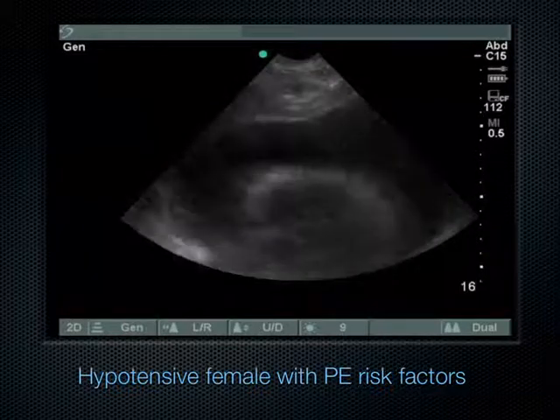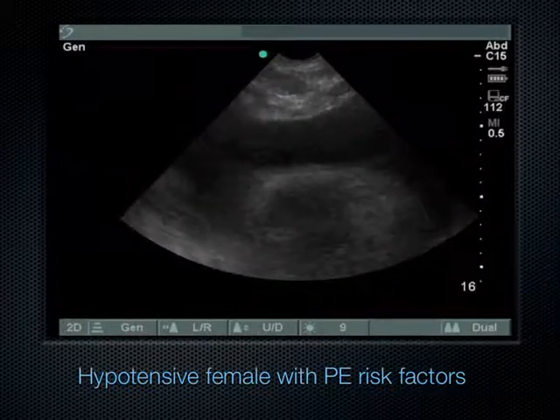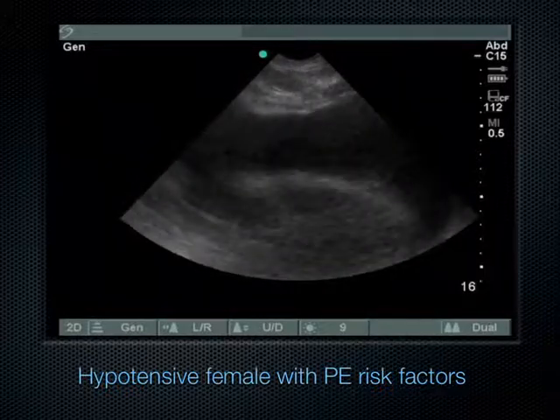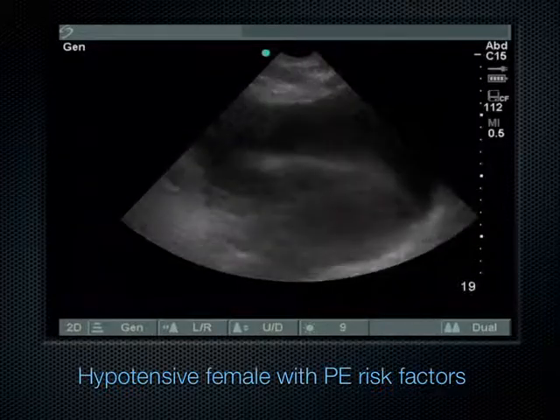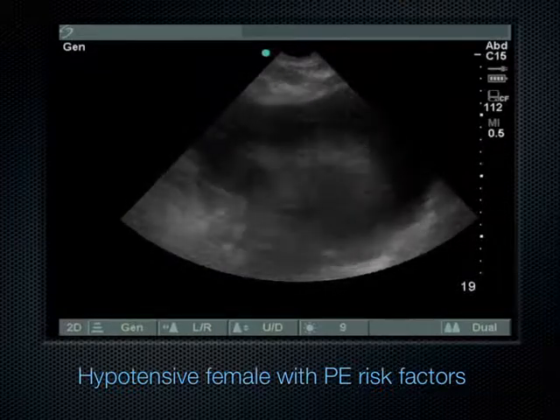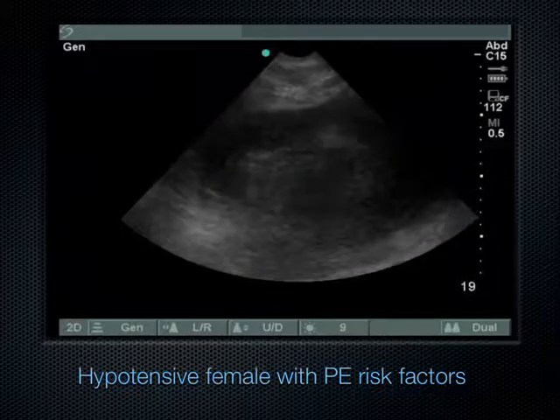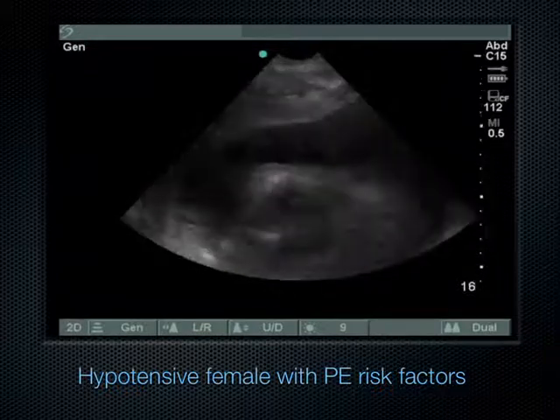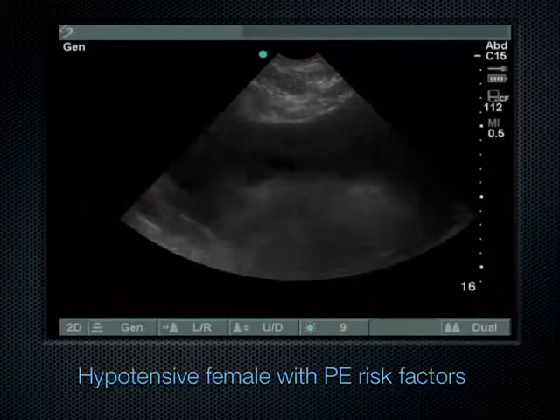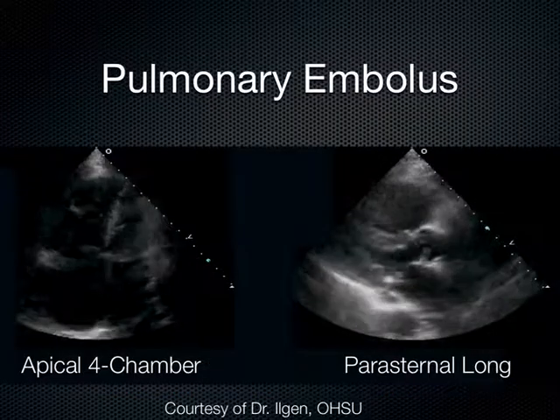So this patient did not get TPA. She got pericardiocentesis, and we drew off 700 cc's of fluid out of her pericardium, and it turned out she had lupus. And you know, if you took a little better history, you'd probably realize that. But at the time, kind of dealing with the low amounts of data and time that we have in the emergency department, I think this is another really good reason to learn how to use ultrasound.